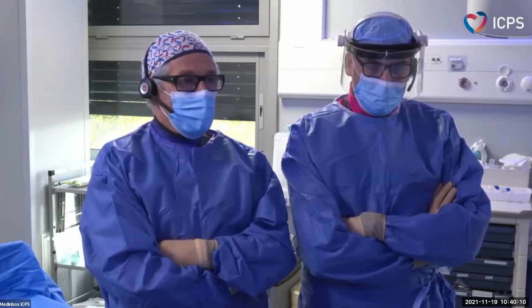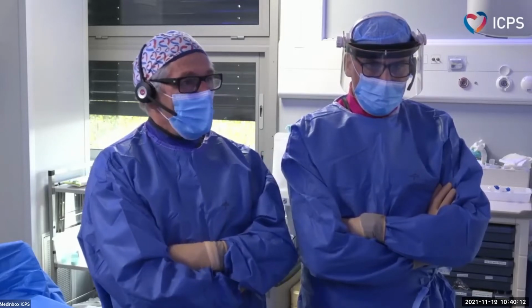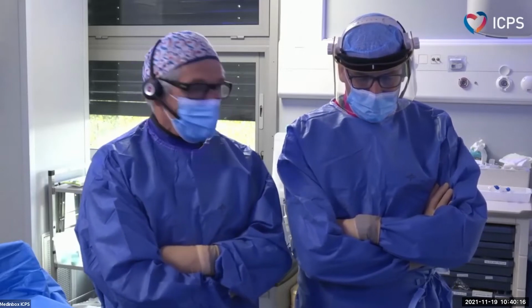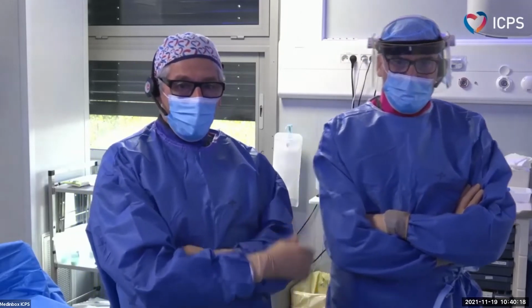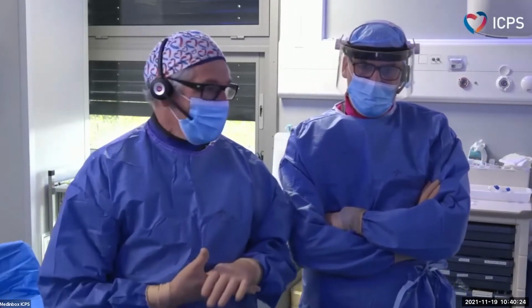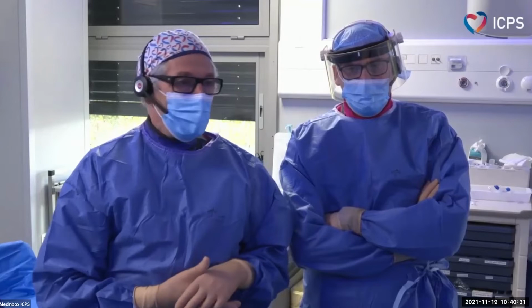We are working on a case which I think will be interesting for the discussion and for the technical approach. So Thomas Ovas will be the first operator. I will be there just to comment on the procedure, explain, or answer any questions that you may have. We have also Sarah as a nurse and Sophie outside who will give the material. So maybe you can start with the story of the patient.